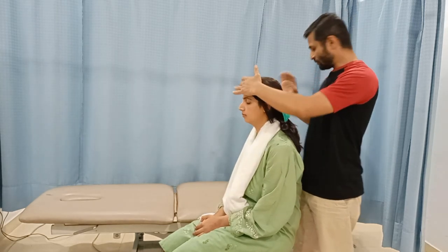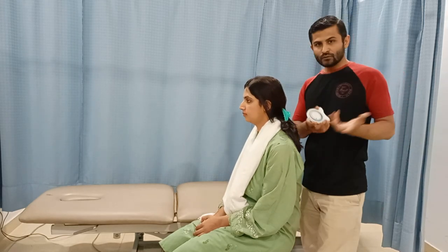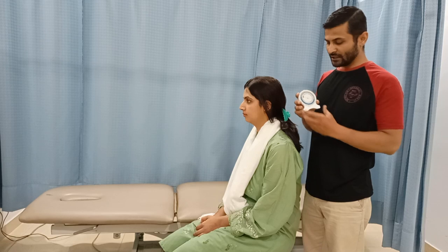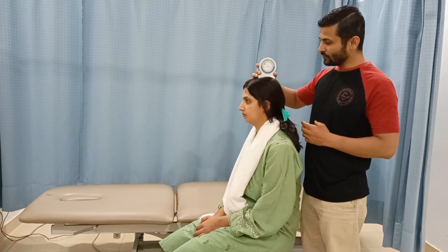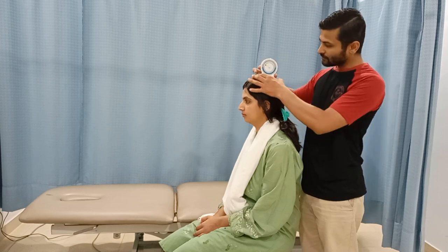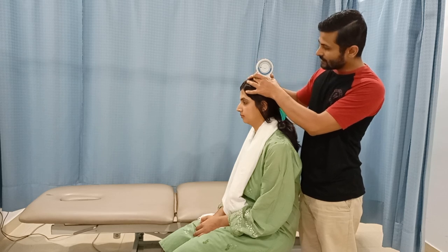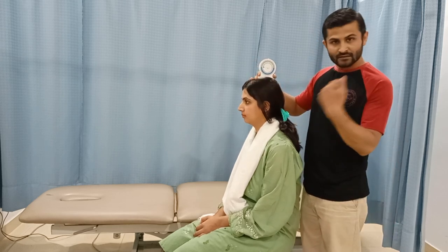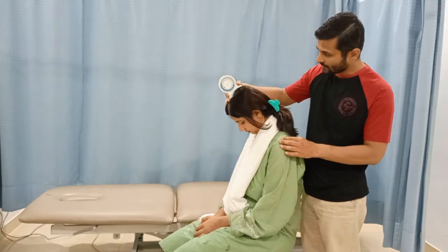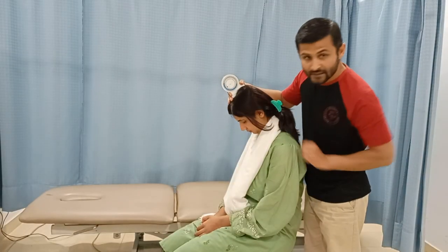Now we need to measure the actual range of motion in degrees. There are two tools available: the universal goniometer and the inclinometer. I am using a bubble inclinometer, which is very easy to use. Place it at the topmost point of the patient's head and set the level to zero. This is the starting position. We request the patient to perform the flexion range of motion — that is about 50 degrees right now.